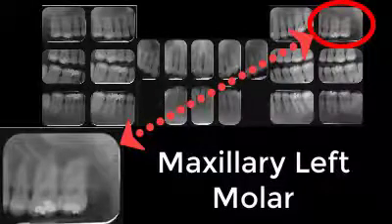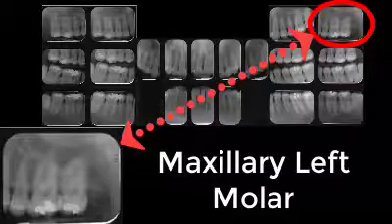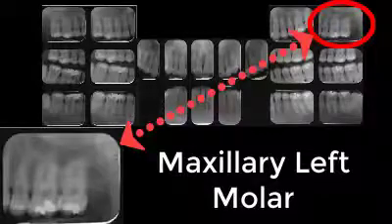Expose the receptor. This exposure should include all crowns and roots of all present molars on that maxillary area and the distal contact of the maxillary second premolars. That would include the apices of the teeth, contact areas, as well as 2 millimeters below the apices in order to include their surrounding structures.